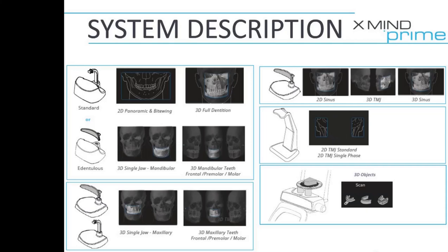Hey guys, I just wanted to go over the chin rest real quick on the X-Mind Prime 2D or 3D. This is the same for the first generation versus the Prime 2.0. You're going to notice the tall one — that's what you use 99% of the time.